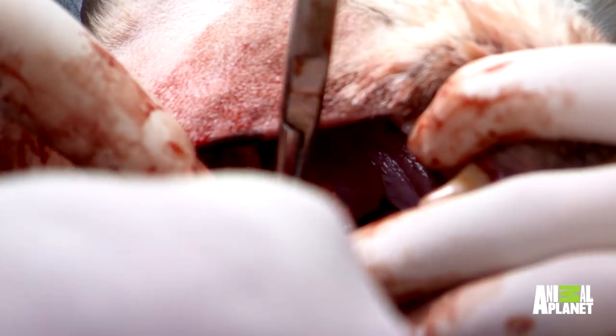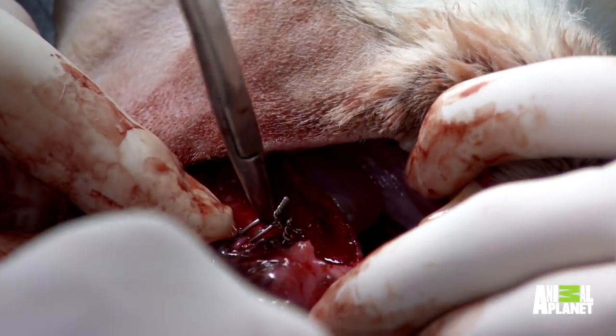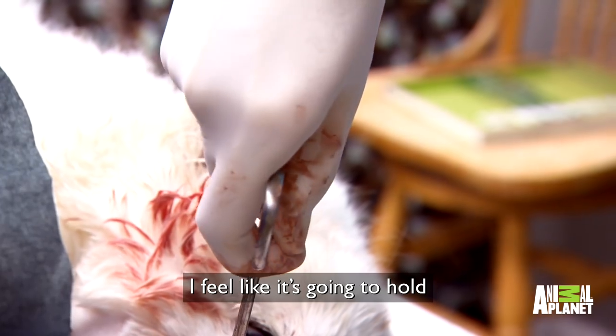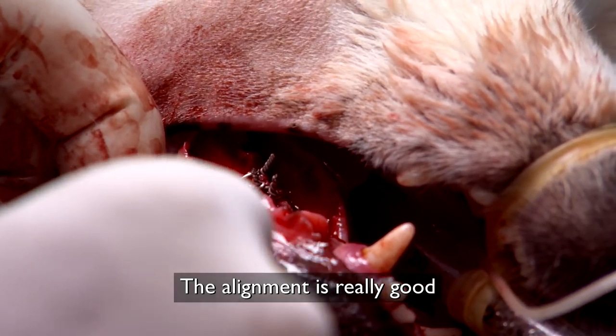The lady's jaw is really thin and brittle. If I put too much pressure on it we're going to break it more, but if we don't get it tight enough it's not going to heal. Stop — the alignment is really good. It's perfect.